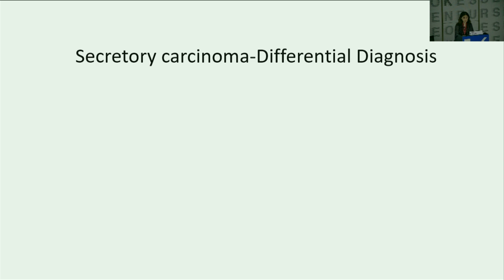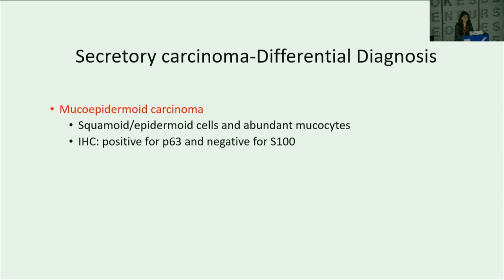Differential diagnosis of secretory carcinoma. Because of the pink cytoplasm, the secretions, and the cystic formation, it might mimic a mucoepidermoid carcinoma. The presence of squamous cells and mucocytes, along with positivity for the squamous marker and negative stain for S100, differentiates secretory carcinoma from mucoepidermoid carcinoma.